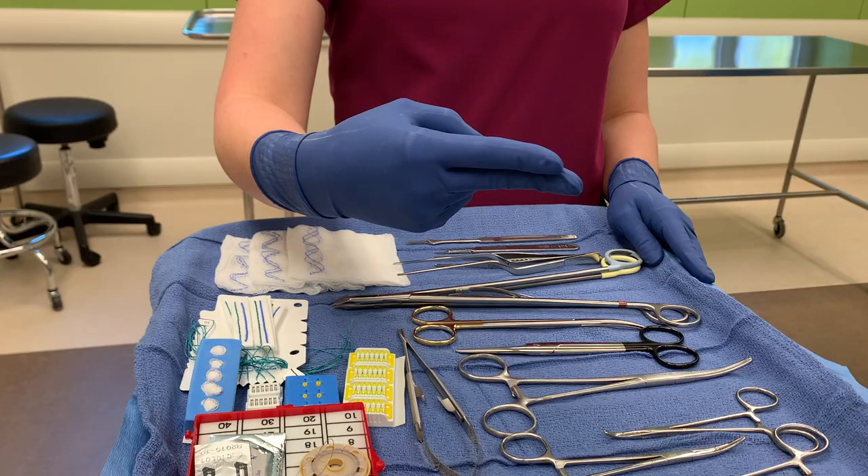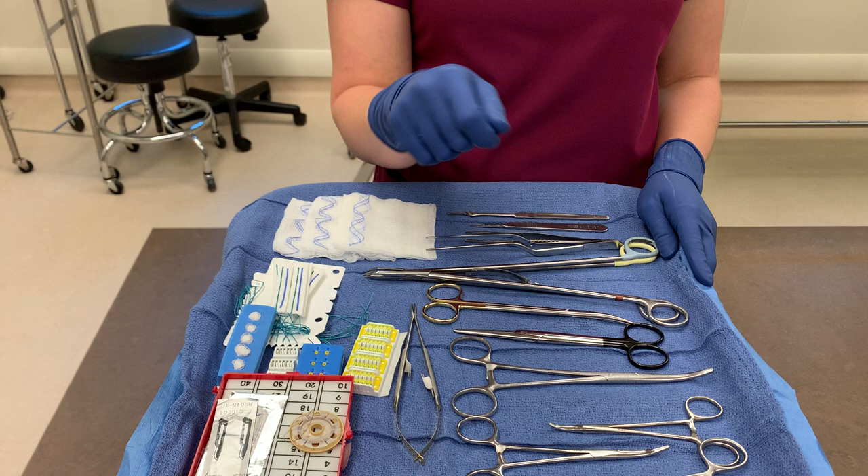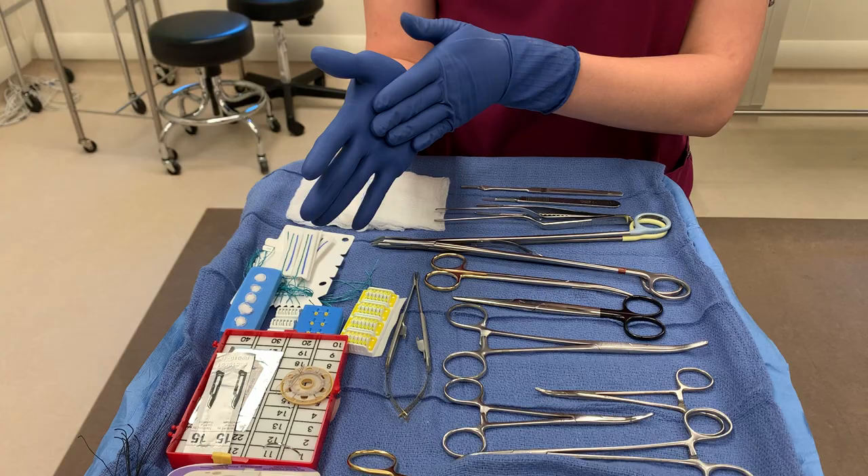Next, if they want scissors and they don't say it, they'll do this right here with their fingers. And then for suture, they do their hand like this — that just means how they're going to throw the suture in the tissue. So that's what they mean if they do that with their hand: they want suture.